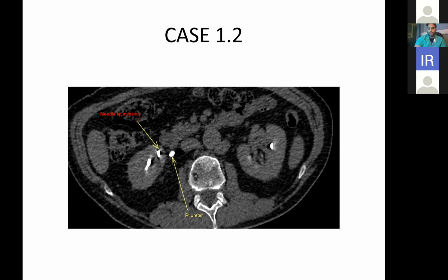So both of the cases that I've shown so far have come back positive for RCC, and I usually take 3 samples, depending on the size of the lesion, of course, and fragmentation of the first 2 samples and things like that. But 3 or 4 is usually adequate.